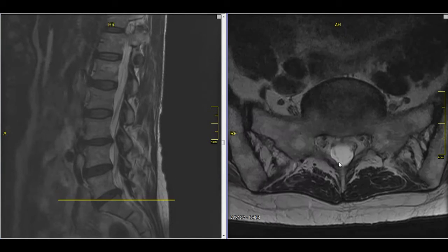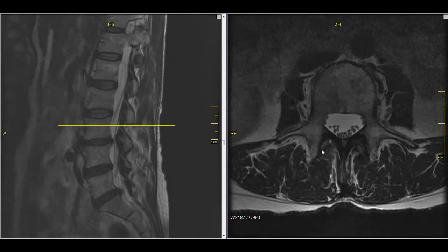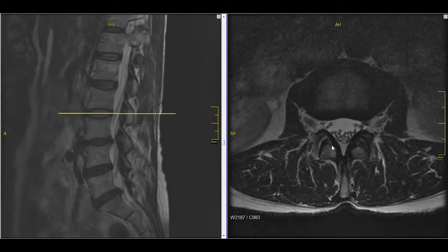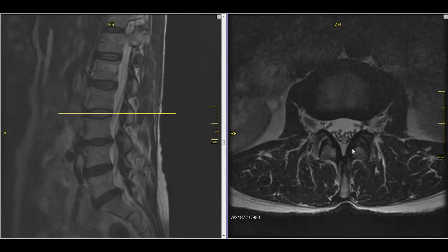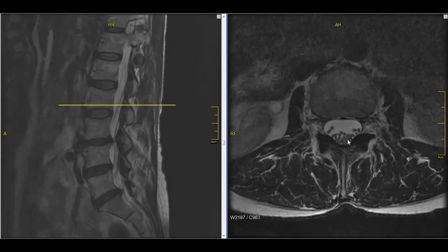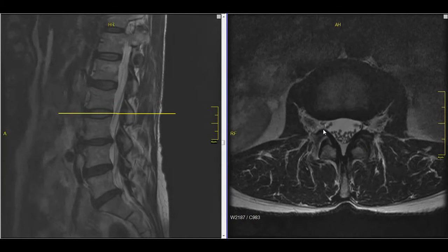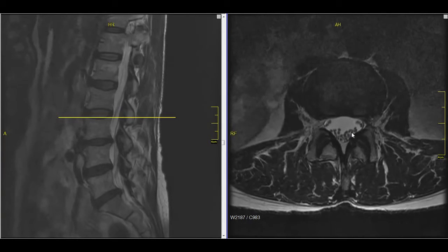Let's look at the axial images in more detail. These are oriented as if the person is laying on their back and we're looking up from the direction of the feet. So this is the back, front, right, and left. The spine is here and the nerve space is here. This would be disc or bone, and the nerves are these little dots. The white is water. Remember how a pair of nerves moves into this corner, which is called the subarticular or lateral recess — that's where the nerve tends to be vulnerable to this kind of disc herniation.